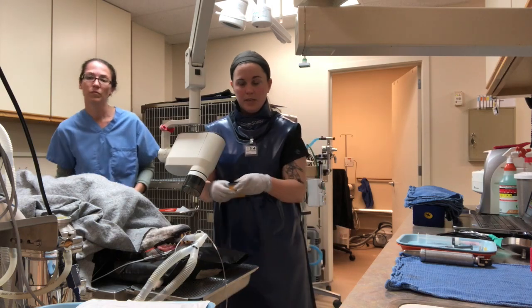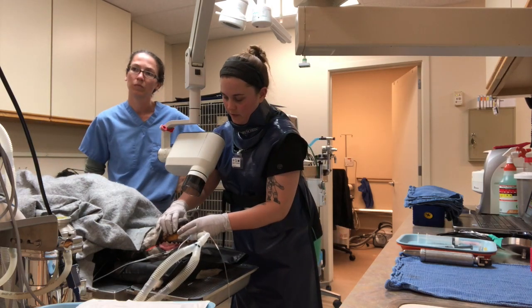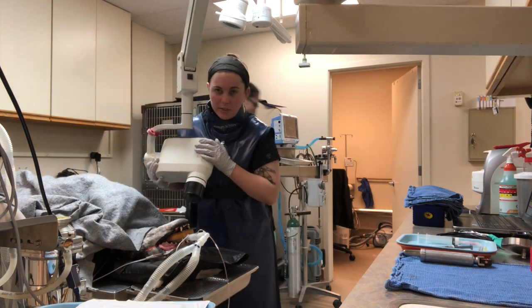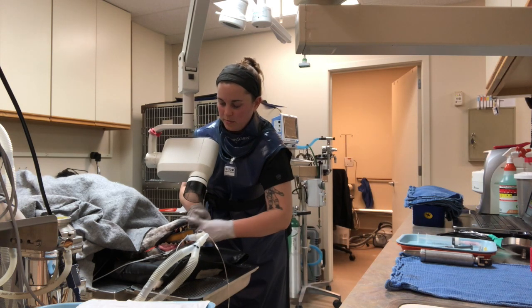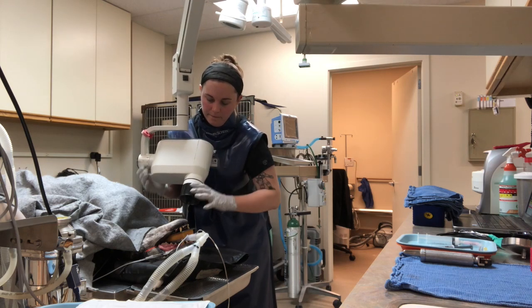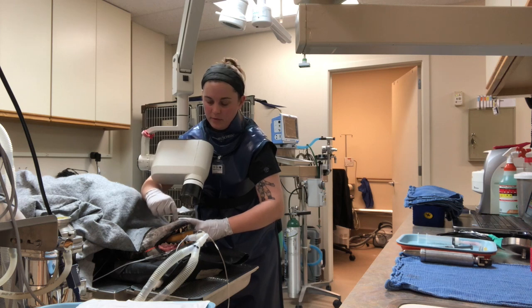And then as that one's reading, I'm going to place our next plate for a canine radiograph on the mandible, the 404 on the right side. And again, I'm using a bisecting angle, so the angle of the tooth and the angle of the plate, I want somewhere in between. Here. And the apex of it is going to be on the rostral, probably in this spot.